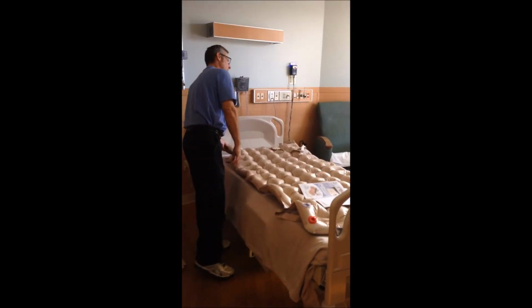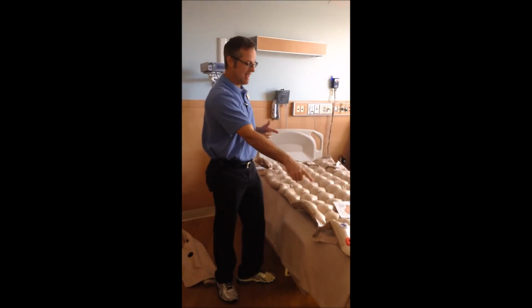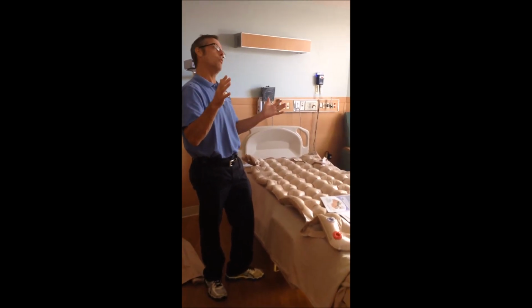Once again, these are extremely comfortable, so if they're ever complaining that it's too hard or anything like that, take that clear valve, let a little bit of air out, and they'll be like, ooh, that was nice.